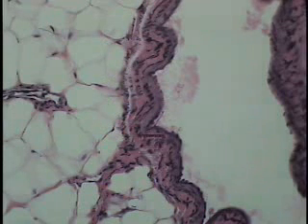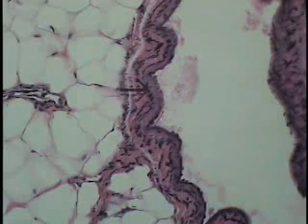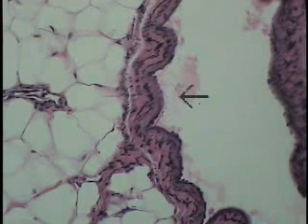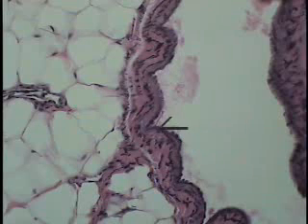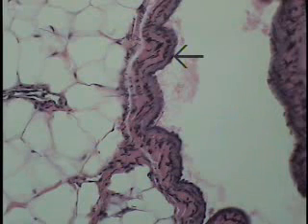The gray, darker background is the tunica media, very thin, and smooth muscle is the primary component of that, and why it is staining this off-gray color. And then finally, you have a tunica intima made up of an endothelial layer and a very thin subendothelial type of delicate connective tissue that anchors the endothelium to the media.